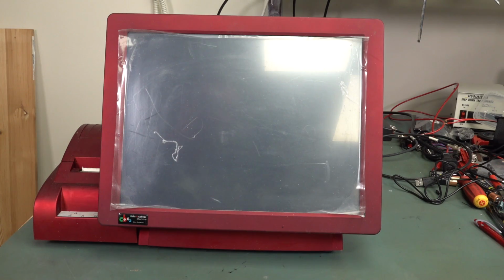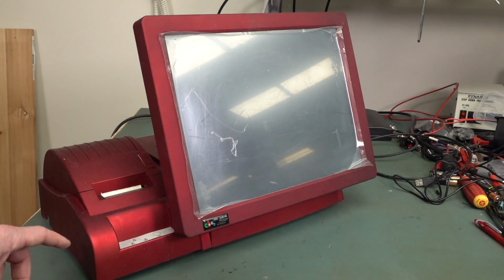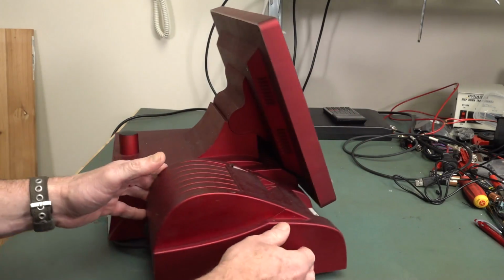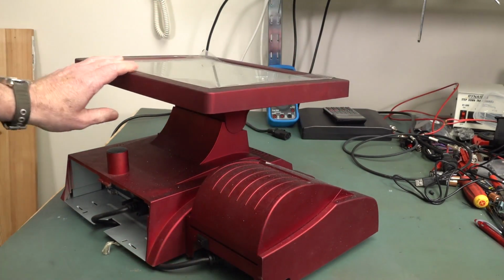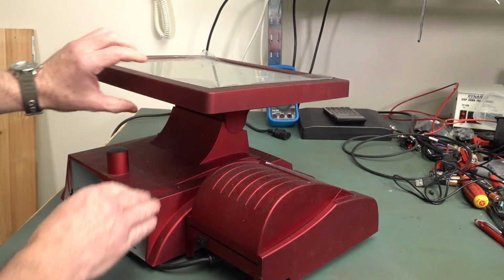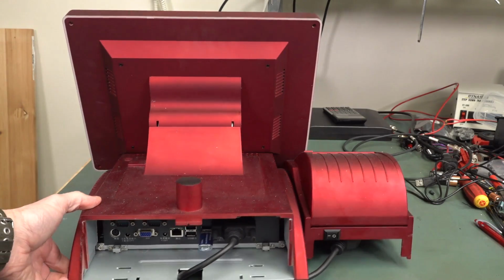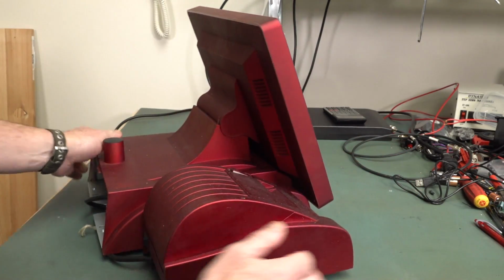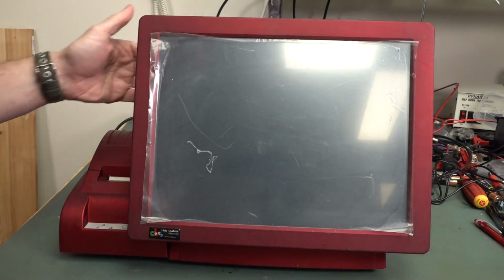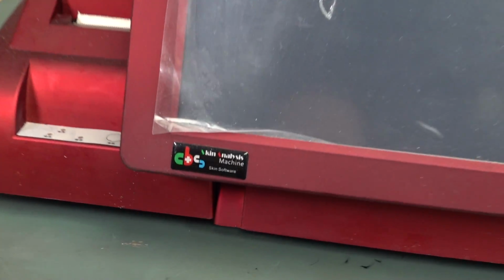Anyway, I've had this one around. I found it in the dumpster. It was kind of unusual, so I picked it up. And look at this. It's got a thermal printer thing, and it's got a tilt screen. It's all a glorious metallic red colored plastic, and it's got what looks like a PC in here. So you might think that this is just some point of sale terminal, some POS system, but no. Have a look down here.